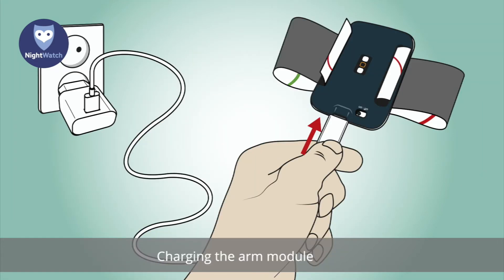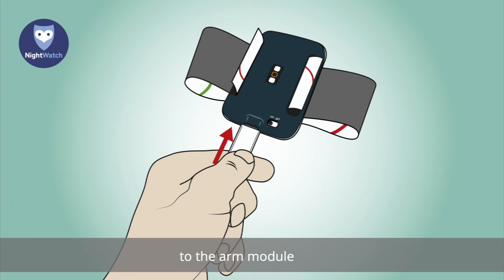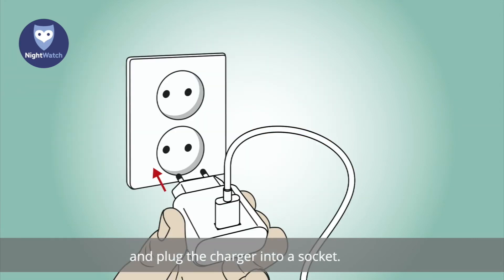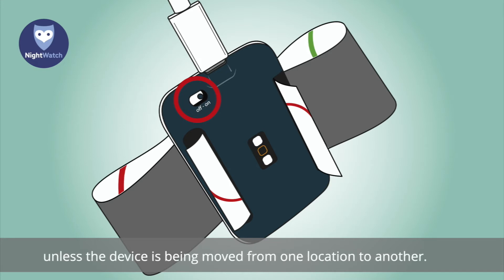The arm module has to be charged before use. Connect the white charger and white USB cable to the arm module and plug the charger into a socket. The green LED lights will switch off when the arm module is connected to the charger during the day. Please make sure the arm module is switched on during charging. The arm module must be switched on at all times, unless the device is being moved from one location to another.